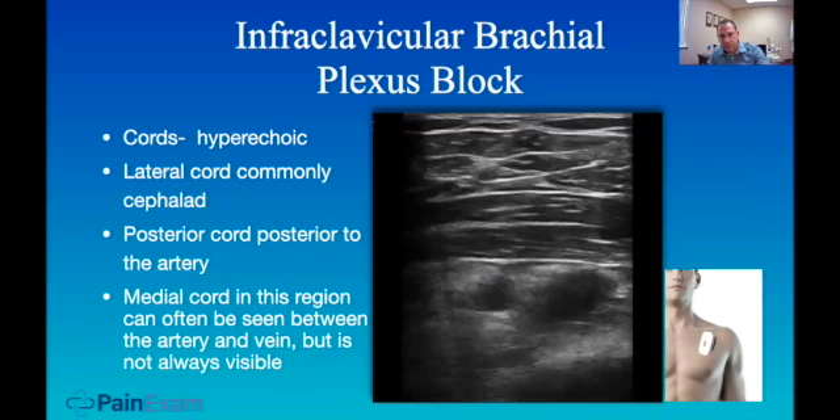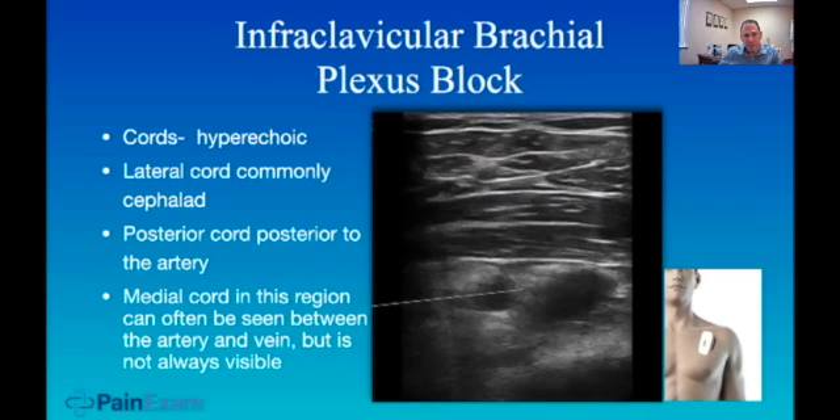Looking at the imaging, the cords are hyperechoic. The lateral cord is commonly cephalad. The posterior cord is posterior to the artery. Here's the lateral cord, here's the posterior cord, and the medial cord is right here — seen between the artery and the vein. The artery is more pulsatile. The vein may be collapsible but can be bigger than the artery.